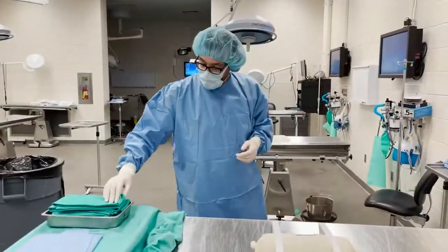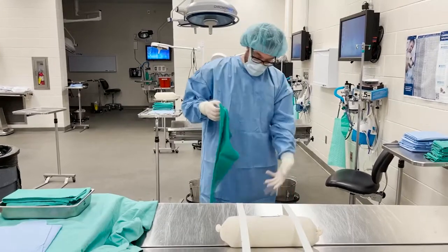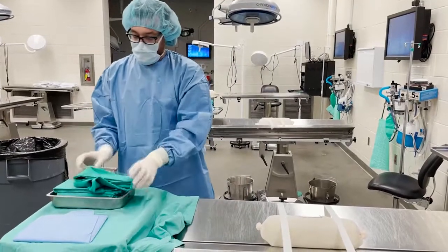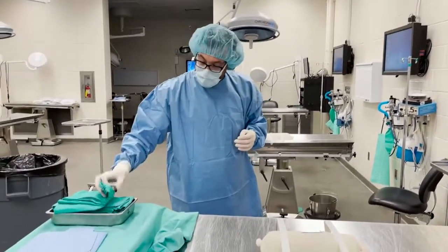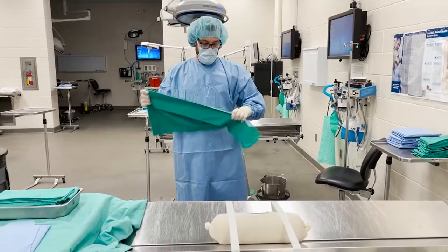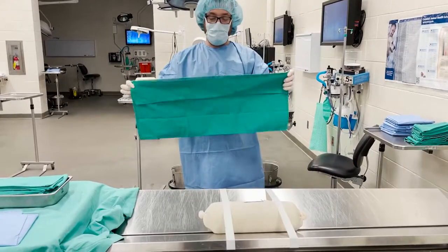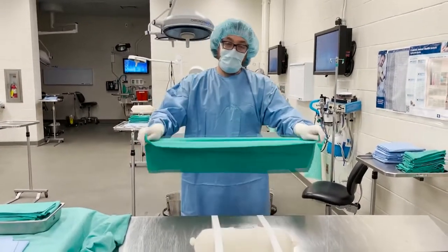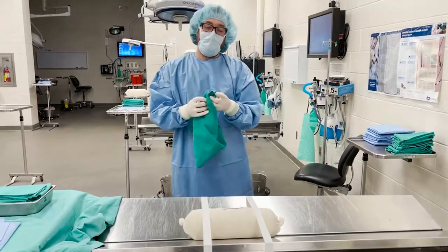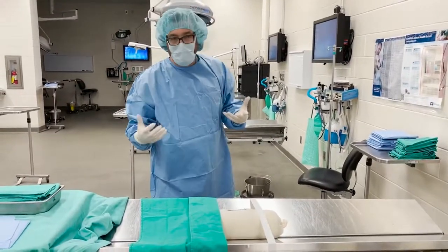When I grab these, I'll usually grab my towel and step away from the table so I don't drag it or let it dangle. My hands are always in the sterile field. I grab my towel and do it very controlled — I'll pinch it and shake it out in front of me. What you want is to have one folded edge; keep that edge folded, and the folded edge should always be facing the patient.